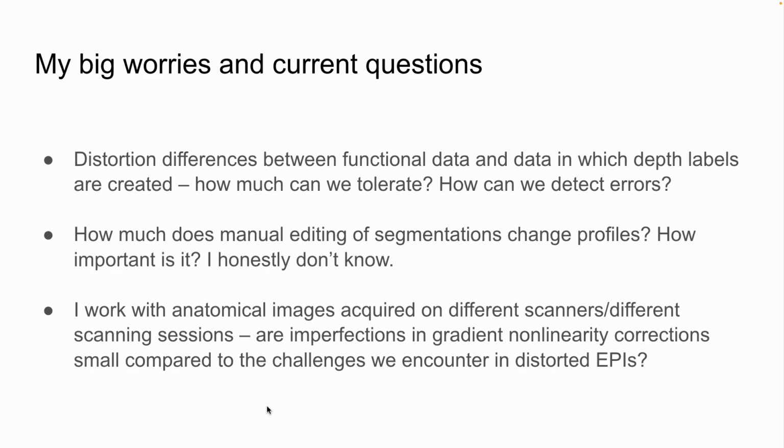And how do we know if our functional data ended up in the right place when we put them down on top of our anatomical data? So that's why the title of my contributions to this workshop is distortion compensation and registration, because that's where I spend my life worrying. And we'll talk more about my weaknesses in a second.